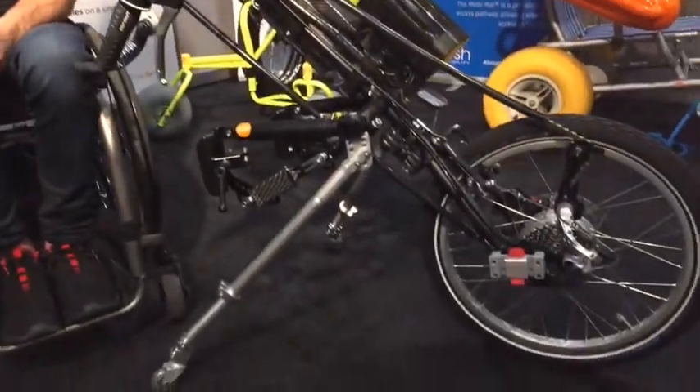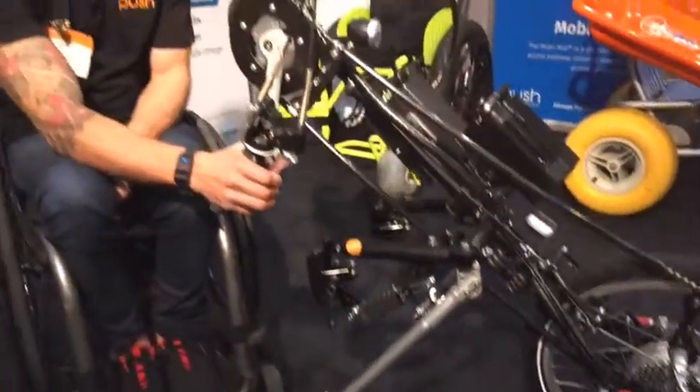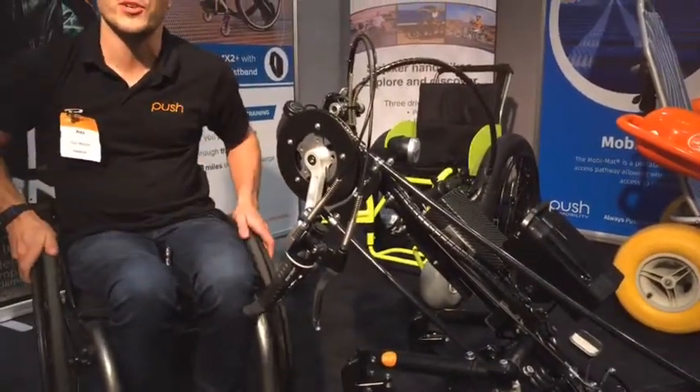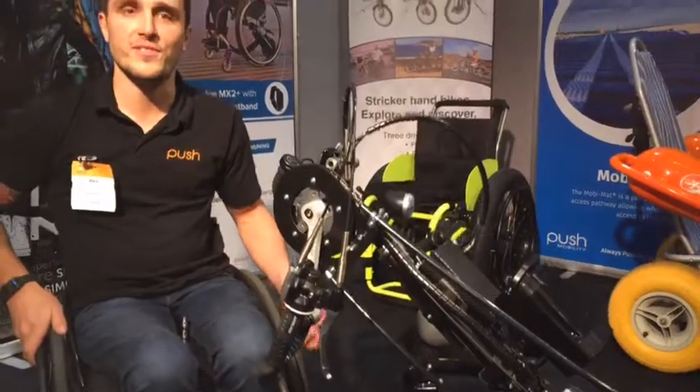With the Hybrid, there are three options in the Stricker range. We do just power, the Hybrid, and then just the pedal. But for the Hybrid option, it allows the pedal and then you've got an accelerator to give you a boost as you go along, which makes starting things a lot easier.